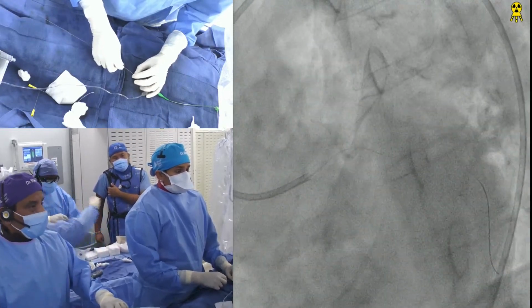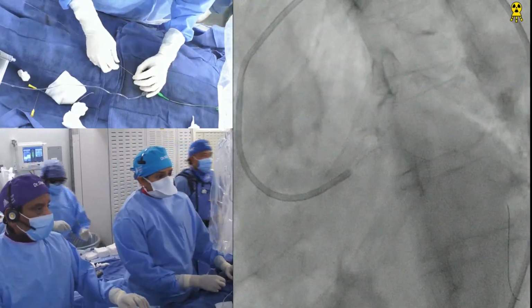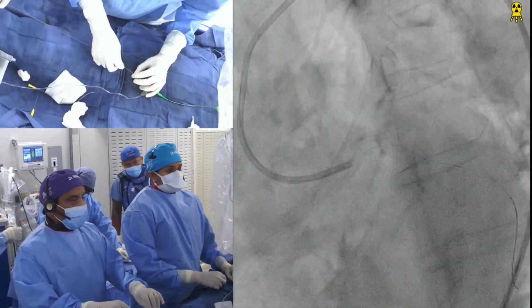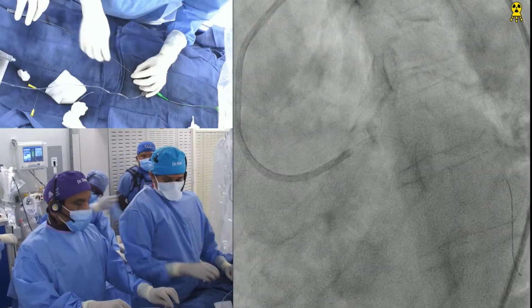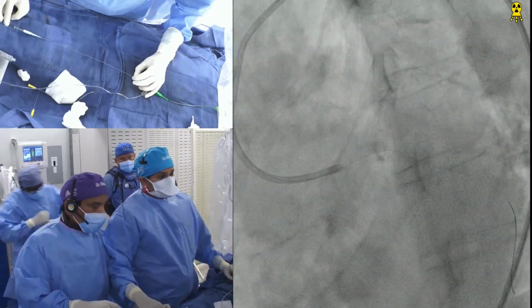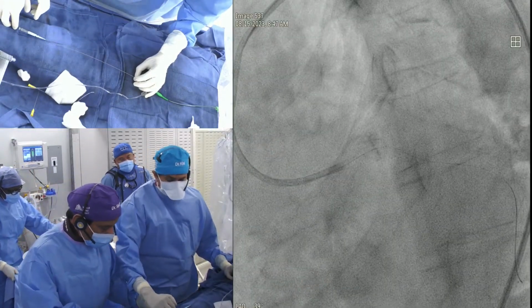So this is a kind of case where even the rota bar may not make that turn, even the 1.25, but then you go to a little higher speed. Every year, of the 600 rota cases we do, there are 2 or 3 unsuccessful. That means the rota wire has gone, but the bar does not go through. And many times you can change it to an extra support wire and so on and so forth. Let's repeat now. So it's separate now.